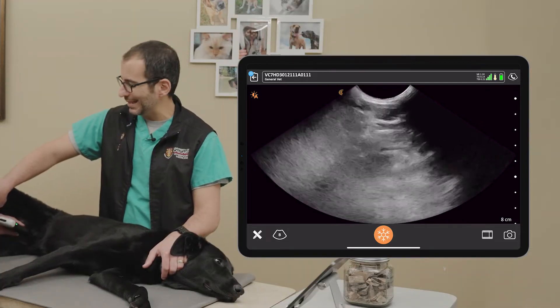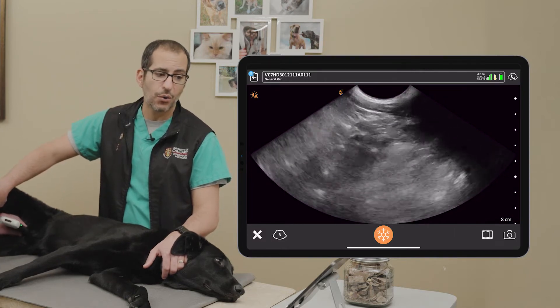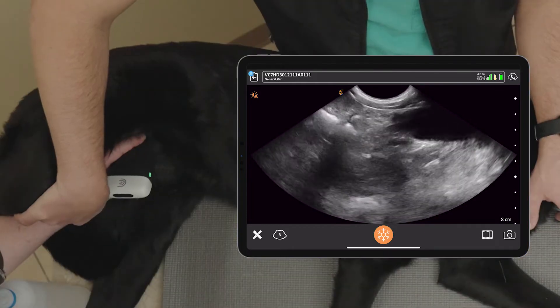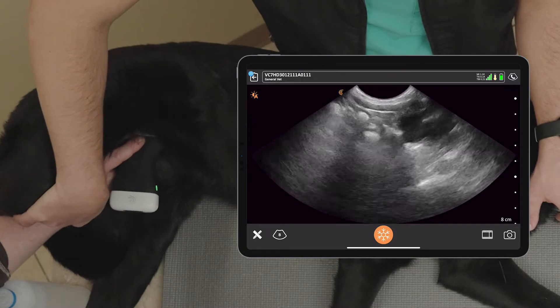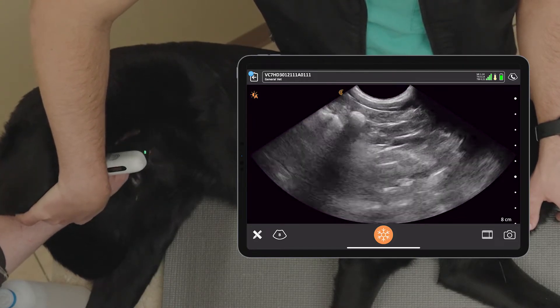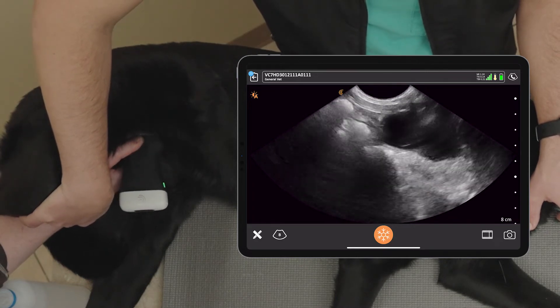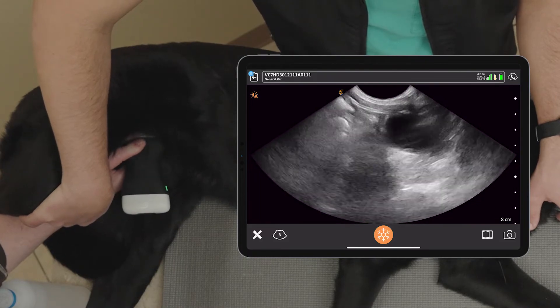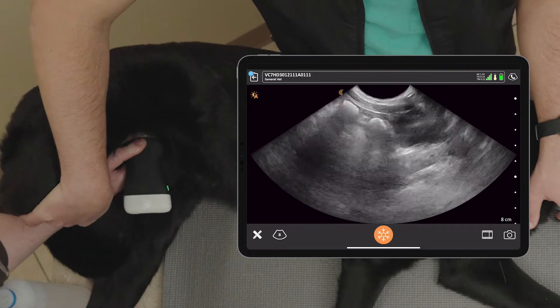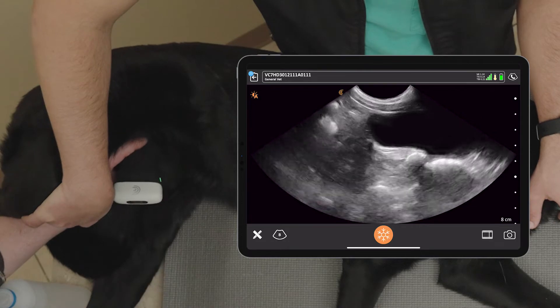The binary questions we want to ask here are: is there free abdominal fluid? Yes or no. And there are some very sensitive sites to find this, one being the apex of the bladder. So right now Penny's got a large bladder, so I'm just going to fan all the way up one side at the apex and I'll fan all the way up the other side. Making sure I do check that gravity-dependent region, but I do want to fan all the way across the bladder. I don't want to get stuck in only one plane and only angled down towards the tabletop because I might miss pathology that otherwise exists in the urinary bladder. There might be stones there or something else I can pick up.